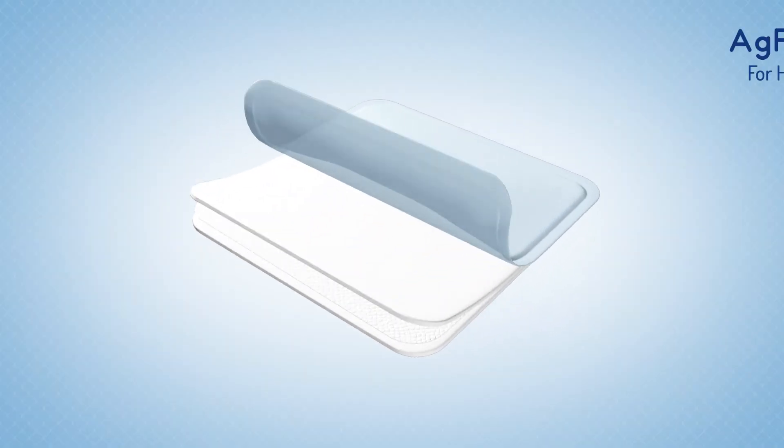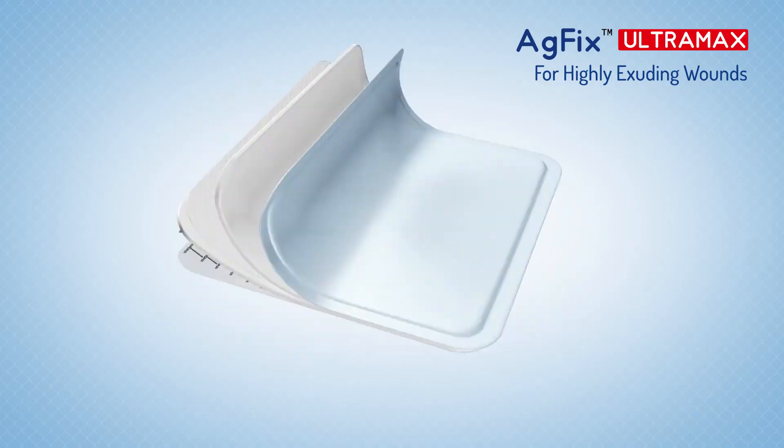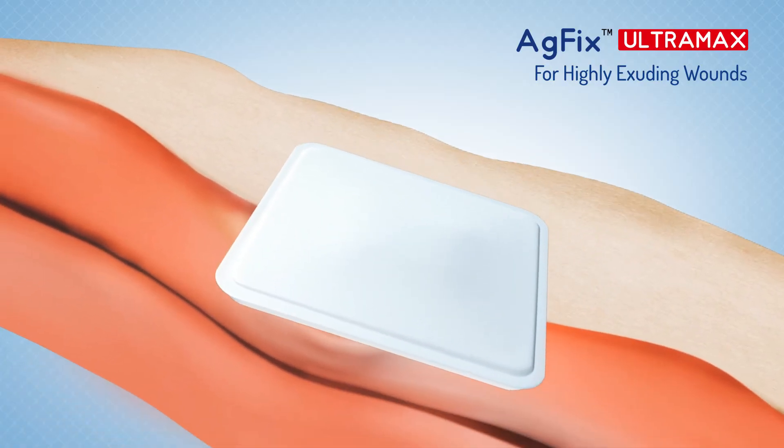The powerful antimicrobial protection of silver and the excellent exudate management capability of the foam pad make AG Fix Ultra Max an excellent choice to manage heavily exuding wounds.